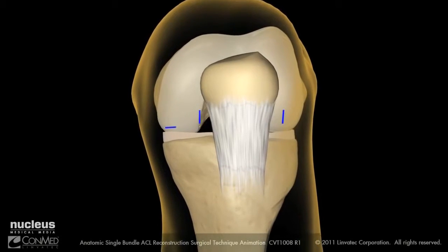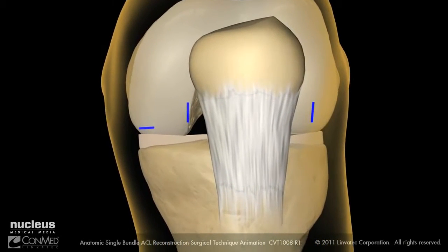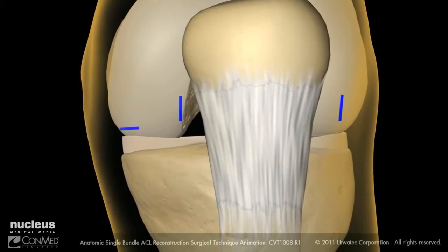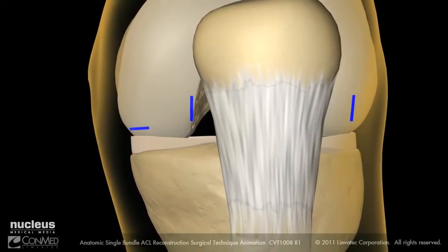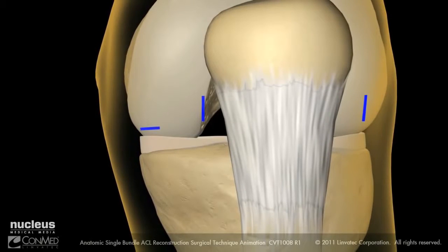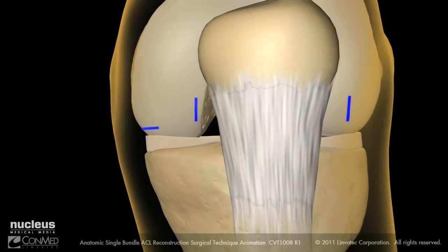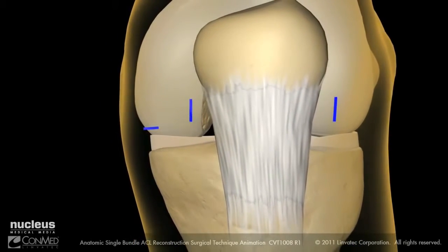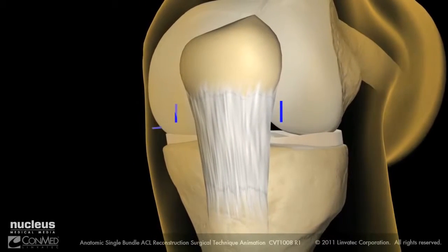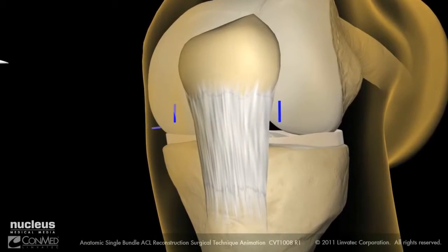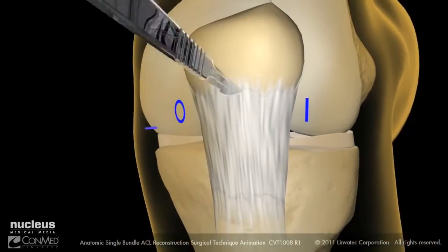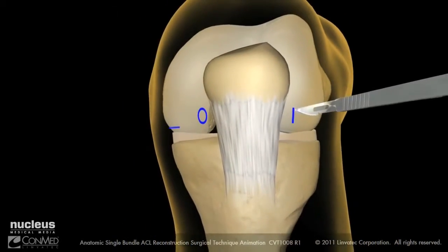The standard anteromedial portal will be used for arthroscopic visualization and should be placed close to the patellar tendon and adjacent to the inferior pole of the patella. The accessory anteromedial portal will be used for drilling and should be lower and more medial than the anteromedial portal. With the surgical markings in place, incise the anteromedial and anterolateral portals.